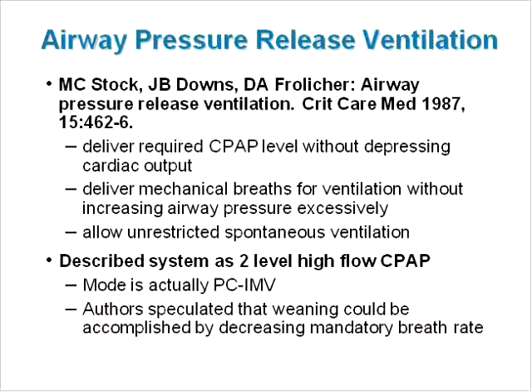This is both good news and bad news. On the one hand, APRV is distinguished from more primitive pressure control IMV control systems that do not allow unrestricted spontaneous breathing. But the bad news is that if clinicians do not understand that this mode delivers actual mandatory tidal volumes, they can easily overlook the fact that these volumes may not be delivered in a lung protective way. That is, they are sometimes too large. We'll go into this in more detail later.